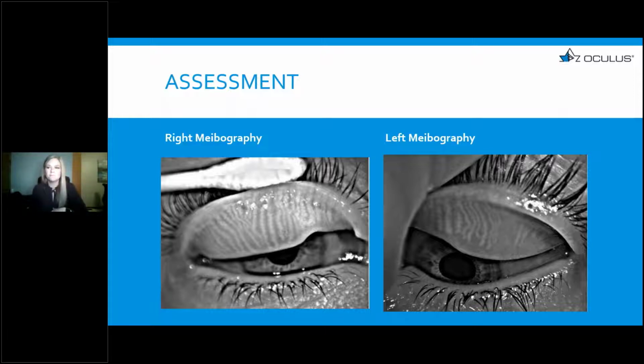What caused that? I don't know. You know what I mean? She's 58 years old. This could have happened at any point in her life. This was the first time we had done gland scans. Could it have been past trauma? Possibly. Maybe an old chalazion that never healed and then got removed. A lot of times patients ask, what caused it? We don't really know. We haven't been doing this imaging for long enough to see, 10 years down the road, 20 years down the road, what is causing all these changes, especially when it's just one focal area. So my instinct told me maybe she had some sort of major infection or injury, something where it obstructed those glands long enough that they just died off.